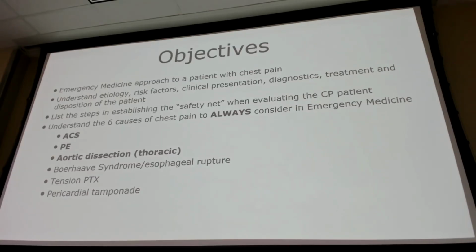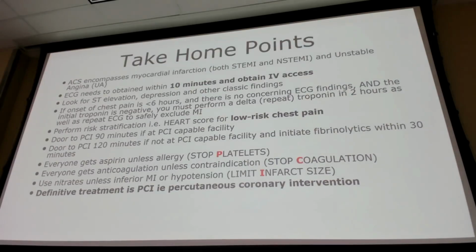These are diagnoses that we need to treat, or need to rule out, when we're evaluating all of our chest pain patients. Some of that we can do with ancillary testing, and some we can base on history. But for all intents and purposes, anybody with chest pain, we normally get an EKG on them. It's not wrong to get an EKG, even if they're young. Then we decide where to go from there, whether I think it's acute coronary syndrome, whether I need to get my troponin, D-dimer, or more imaging on top of that. We'll get into a little more on the causes.